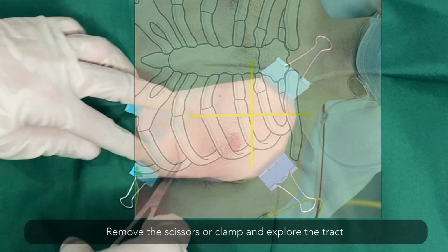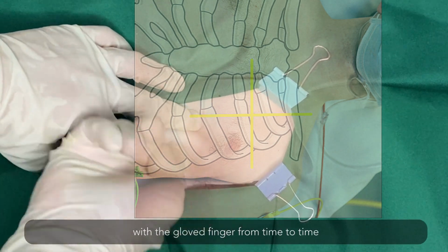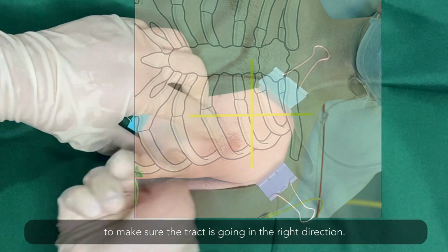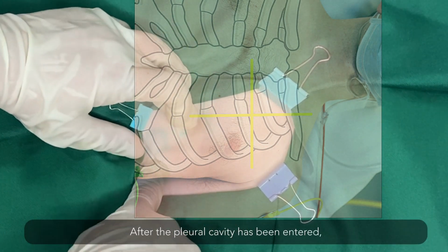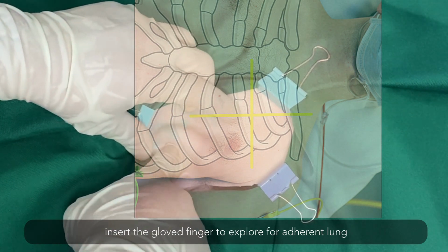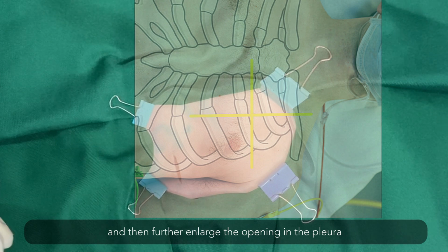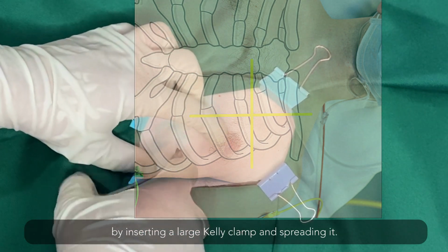Remove the scissors or clamp and explore the tract with a gloved finger from time to time to make sure the tract is going in the right direction. After the pleural cavity has been entered, insert the gloved finger to explore for adherent lung and then further enlarge the opening in the pleura by inserting a large Kelly clamp and spreading it.